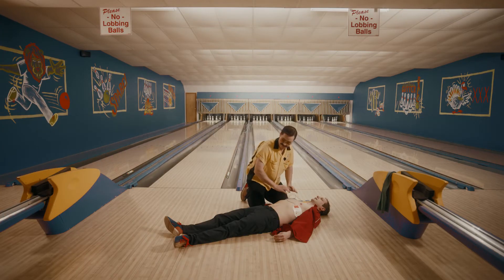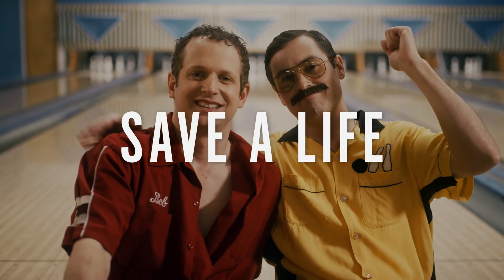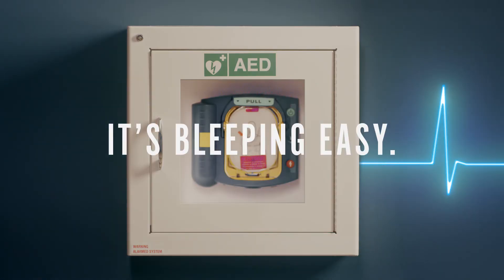Follow the instructions and remember, an emergency medical dispatcher is with you every step of the way. That's it. You're now prepared to save someone's life. AED — it's bleepin' easy.